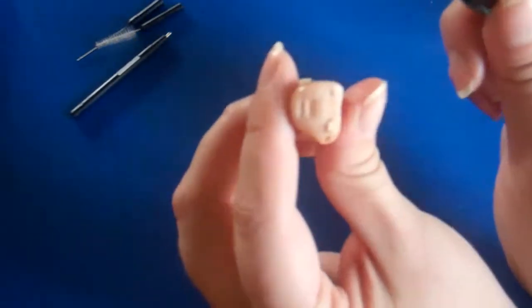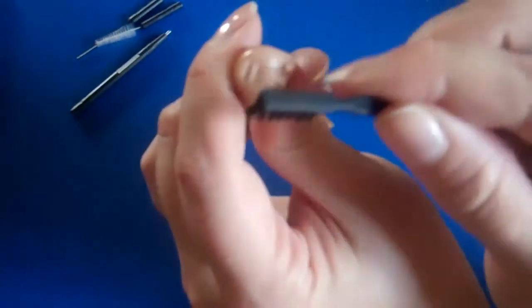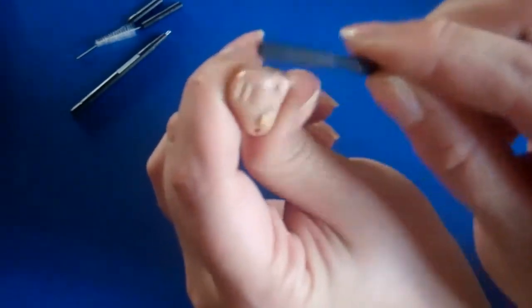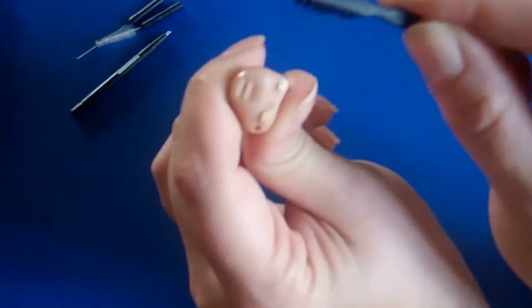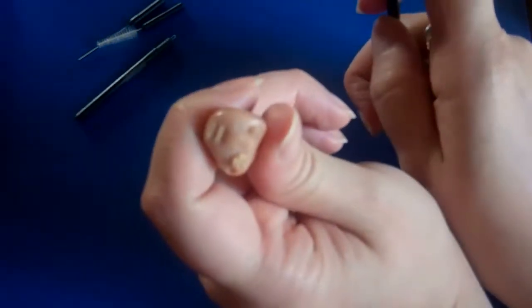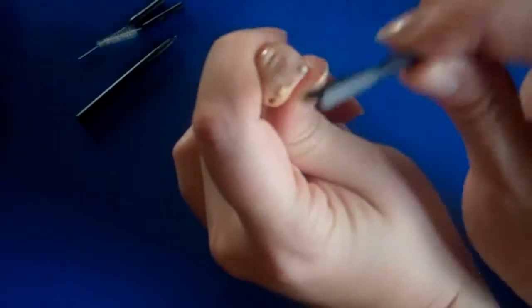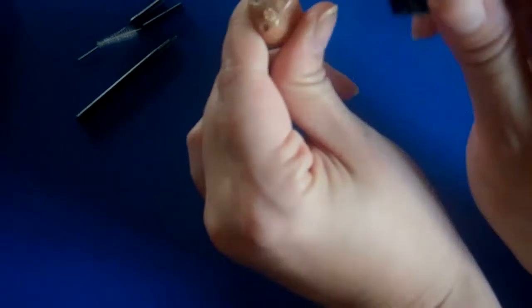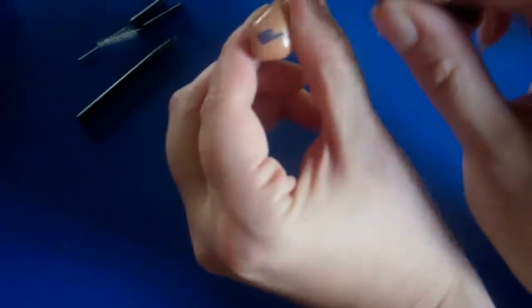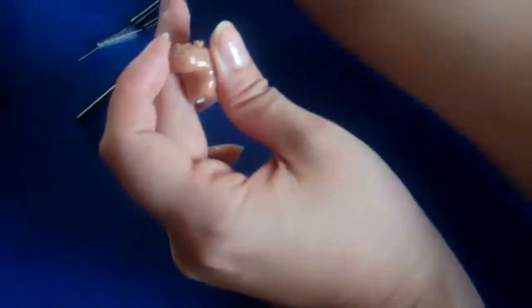However, most importantly is your microphone. It's very important that you brush off the microphone at least once a week to ensure that nothing gets in it or blocks it, because otherwise you'll get no sound. If you are a heavy hairspray or hair gel wearer, we ask that you brush the microphone off every single night. Again, you can use this brush anywhere you see anything. It won't do any damage.